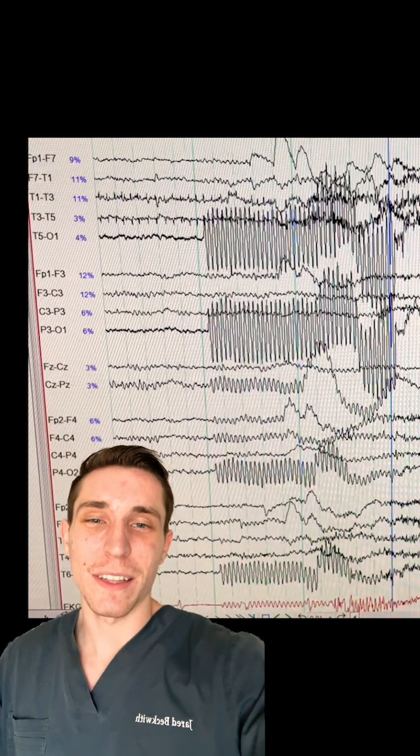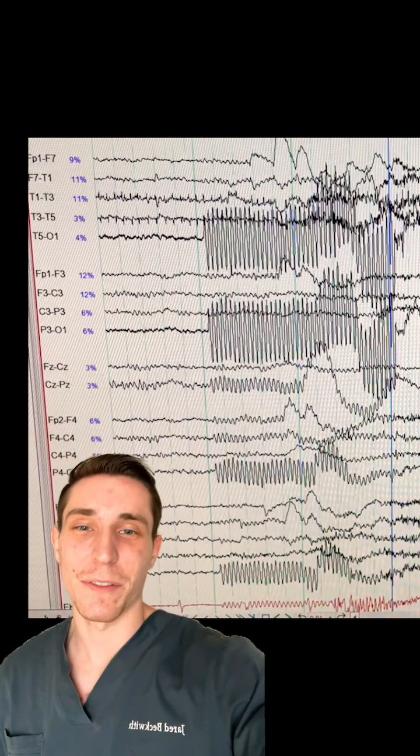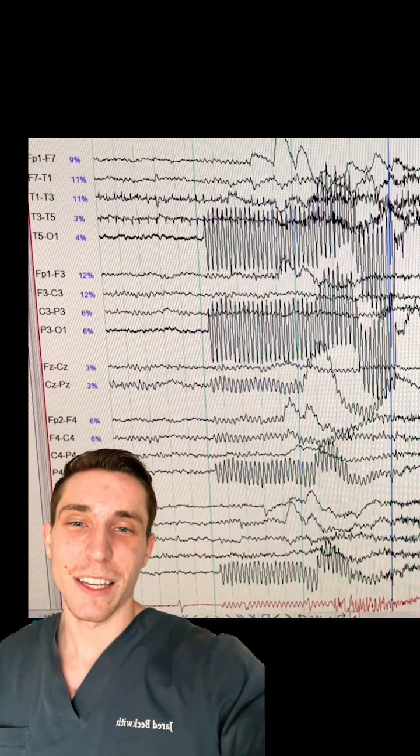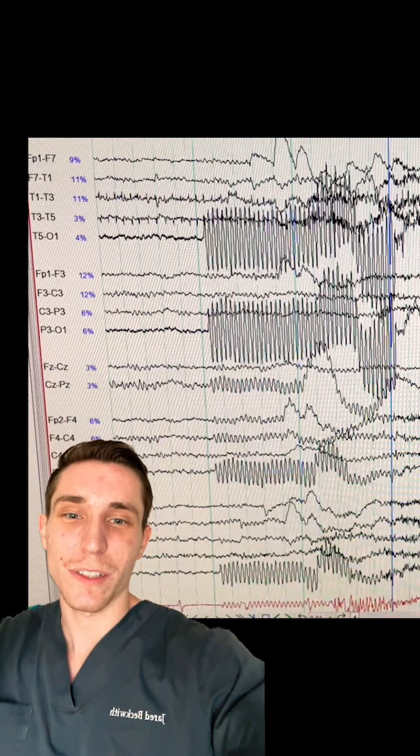Artifact is something that's not coming from the brain. Now, this, in fact, is not coming from the brain. It is actually coming from another source.